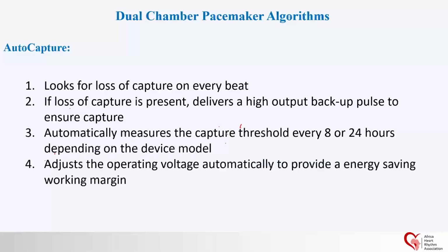That means if the pacemaker fails to depolarize the myocardium, this algorithm will give a backup of 5 volts to depolarize the myocardium as a backup of security. And this algorithm will automatically adjust the amplitude of the output in the ventricle.